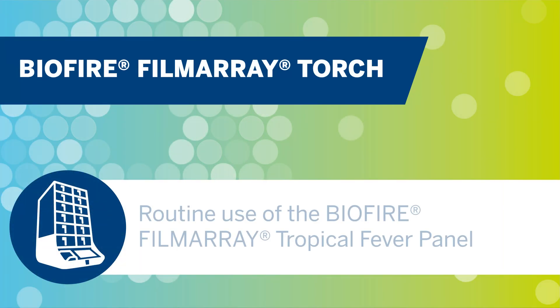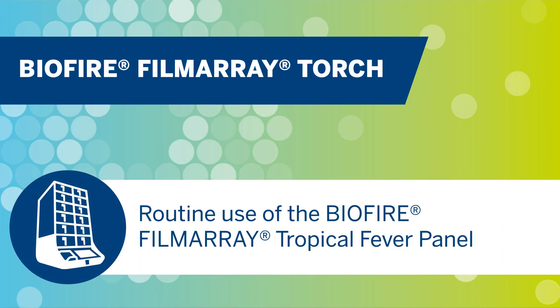Hello and welcome to the training video for the routine use of the BioFire Film Array Tropical Fever panel. This video will discuss the setup, loading, interpretation, and quality control requirements for the Tropical Fever panel.